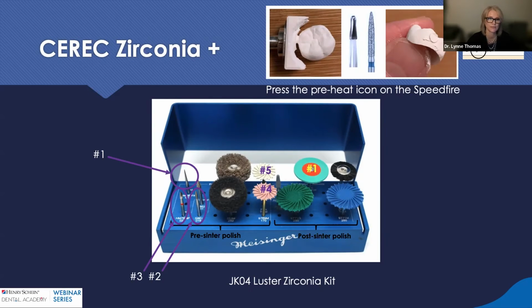I will then use this green twist to get into some of the occlusal details that I may have created in my crown design, and finish up with the blue twist. And the blue twist is maybe a maybe. Sometimes I need it to refine some of the polishing on the inside, meaning the occlusal table. And sometimes I'll just go around the periphery with it.